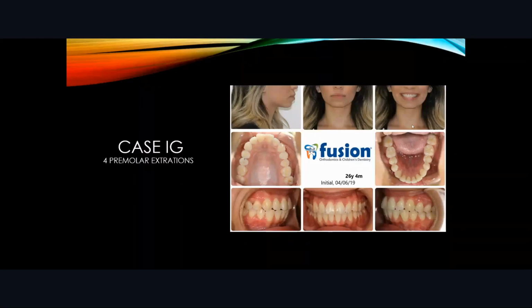The problem was that she had an upper right 5 that was painful and needed a root canal. So instead of 4s, we decided to keep it symmetric. We decided to do all 5s for her.